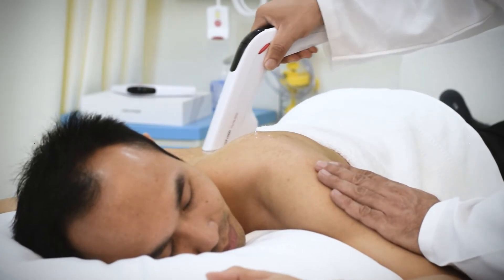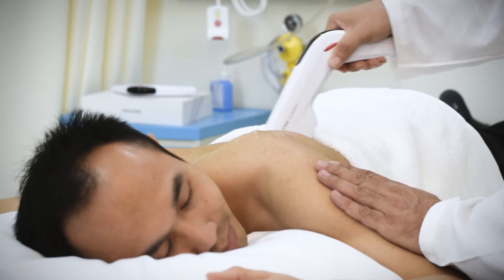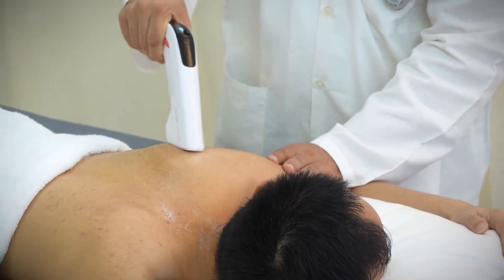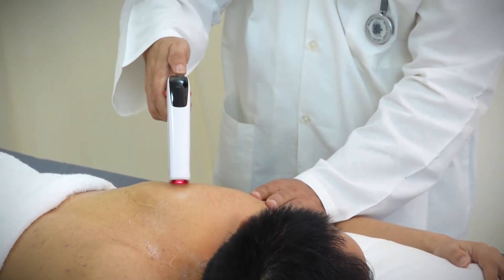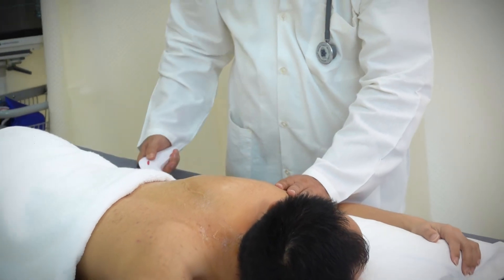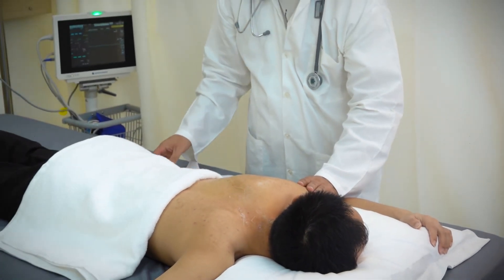Continue the treatment for 10 to 15 minutes depending on the severity of the condition to get the best results. Turn off the device after completion of the treatment. Reduce the duration gradually in the follow-up treatment sessions as the patient recovers.